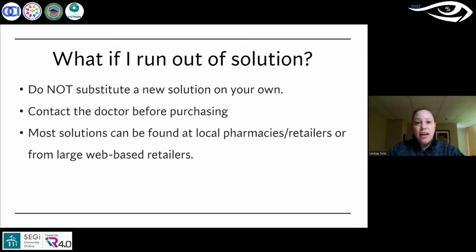So to help educate your patient, you can let them know that this is the solution that we recommend for you. And the American Association of Contact Lens Educators, AOCLE, has a downloadable handout on their website, and you can get it in several different languages. It guides your patient through their orthokeratology lens care, healthy habits that they should have, and you can write their solution down on that sheet of paper and hand it to them.